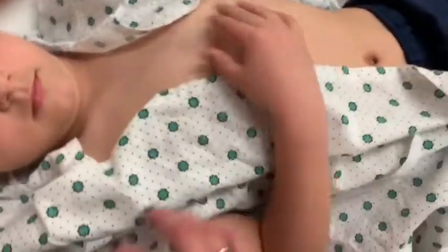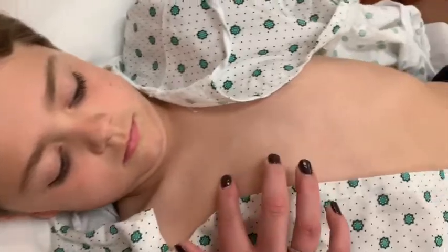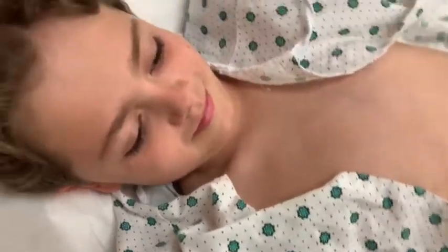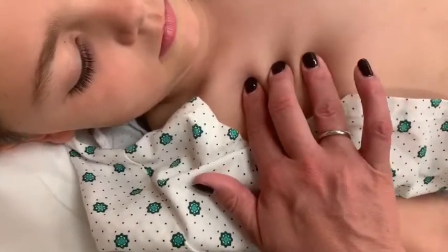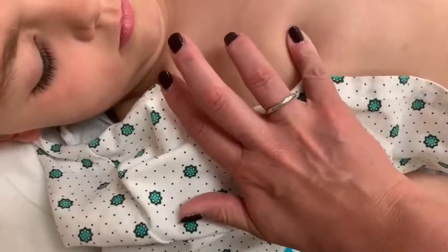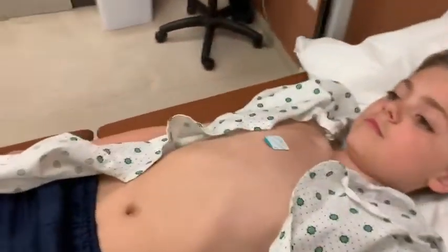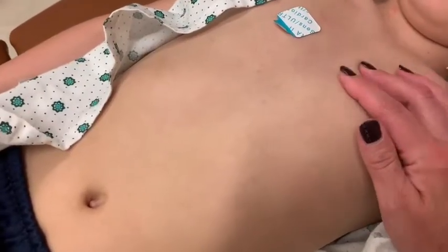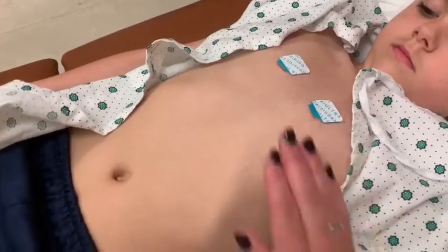So now I'm going to do V1. V1 is going to go at the fourth intercostal space to the right of the sternum. Here's Colton's sternum right here, so I'm going to count down four intercostal spaces. We're going to put those fingers right in those intercostal spaces and feel — so that's one, two, three, four. Right where that fourth intercostal space is I'm going to put this lead right there. Then V2 is going to go at the fourth intercostal space to the left of the sternum. V1 and V2 are the only ones that actually go in the fourth intercostal space, and V1 is the only one that goes to the right of the sternum. All the rest go to the left of the sternum where the heart belongs.